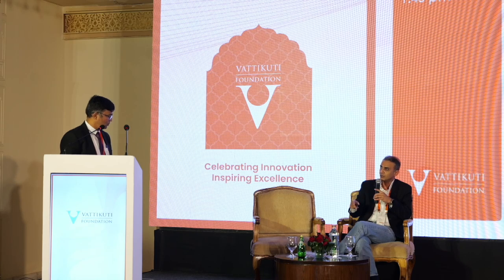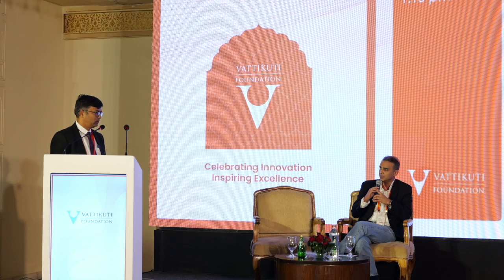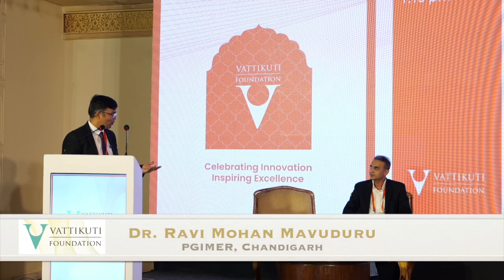So you have got a laparoscopic Satinsky. Because I feel that if you use only the loop, or if our bulldogs are not that reliable, they can be relatively loose. So I think Satinsky is another thing which we can think of using. No, I think it's Bulldog or Satinsky. I'm not sure whether it makes a real difference, but we would take that. We did not have a problem as of now, so we are happy, lucky that way.